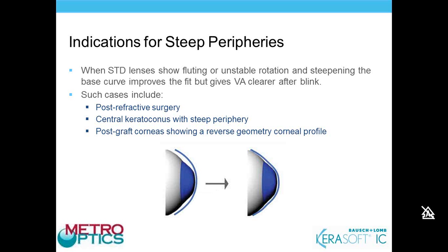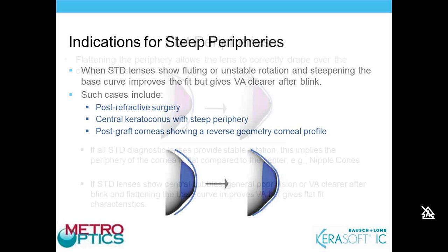So you could actually try a steeper lens in your fitting set and see if it meets the Morrison criteria ideally, or you could actually try the 8/6 steep 2 lens that is already in your fitting set.